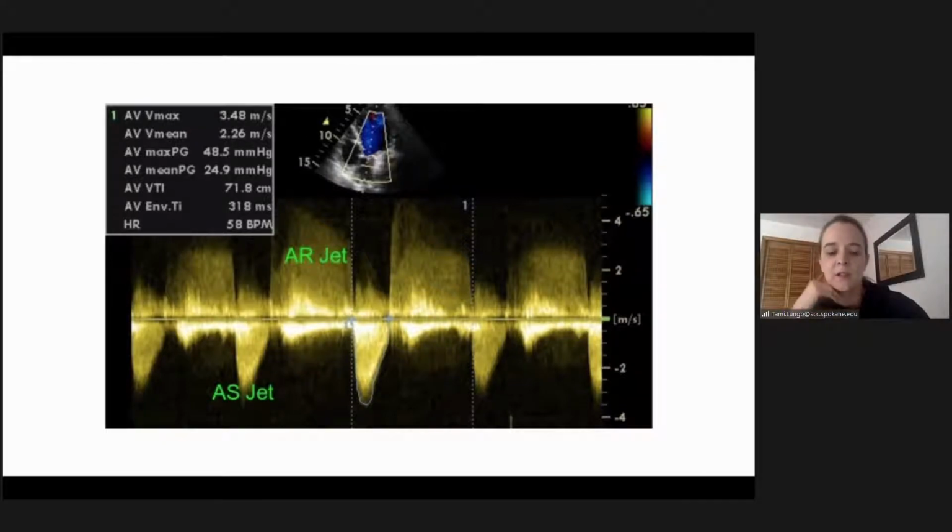I've had doctors come in and wonder if we measured it right, and then you pull it up on the machine. So it does look overgained here. However, on the machine, maybe it was a little bit different. But yes, I would definitely take that in. I don't think it's so bulbous there at the end like that person swung it out.